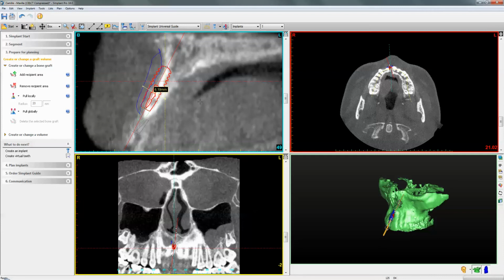When you fold it, you can fold it up to 4 millimeters, and that is 2-in-1 as well. It's a bone graft plus a membrane, and it ossifies really well. And then you've got the O6 Plus, which is a membrane, but it ossifies. So I think it's a brilliant product. You should definitely look into it.